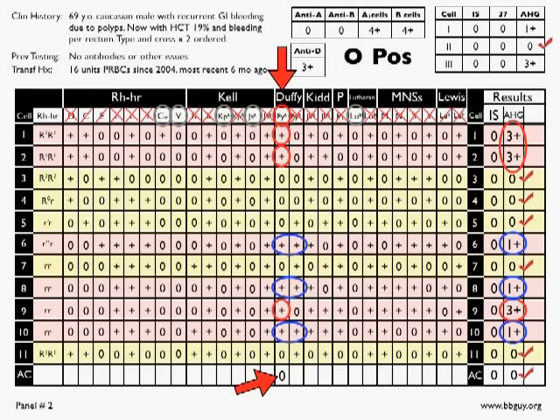Again, don't expect, is this Duffy A? Is this anti-Duffy A? Expect questions along the lines of racial differences in Duffy A, with African Americans being far more common to lack Duffy A and Duffy B, the thought about delayed hemolytic transfusion reactions associated with Duffy A, and Duffy antigens being destroyed by enzymes. Things like that are the level of questions that you should expect to see. All right, so that's panel two.